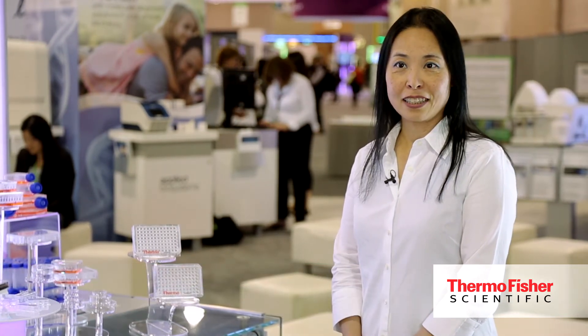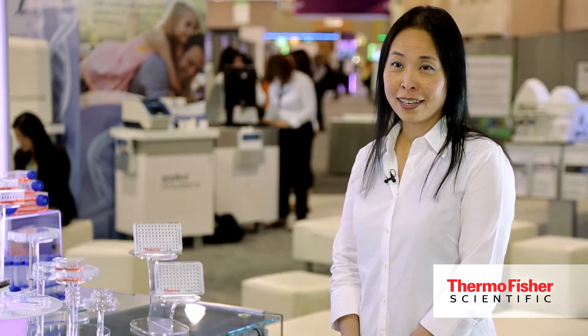This week at AACR, we are highlighting some of the specialty cell culture consumables that are specifically designed to facilitate cancer culture and analysis.